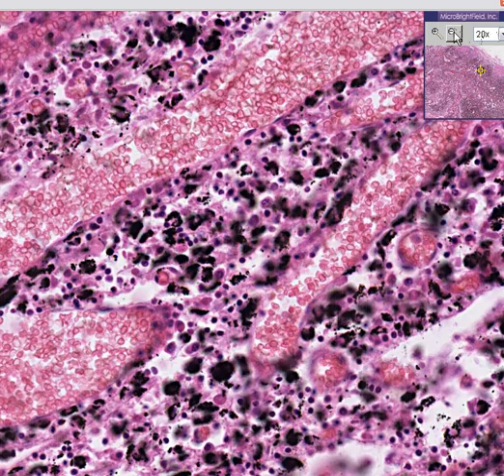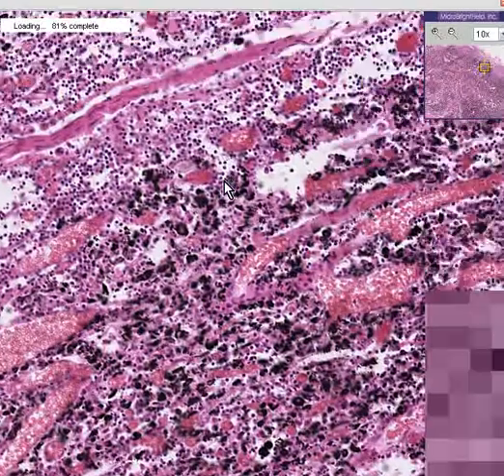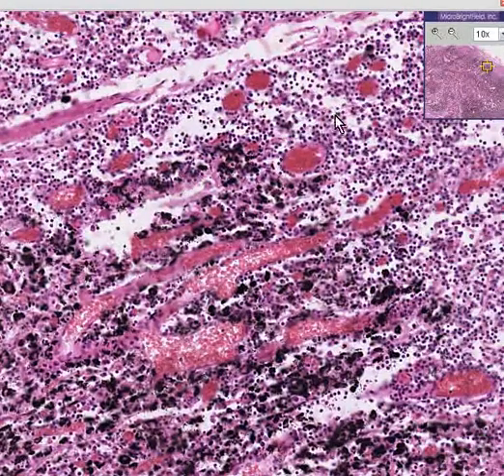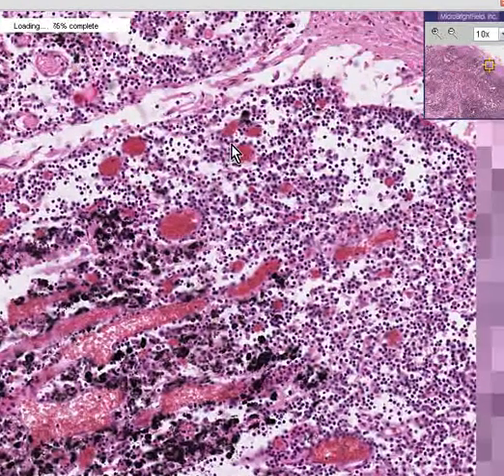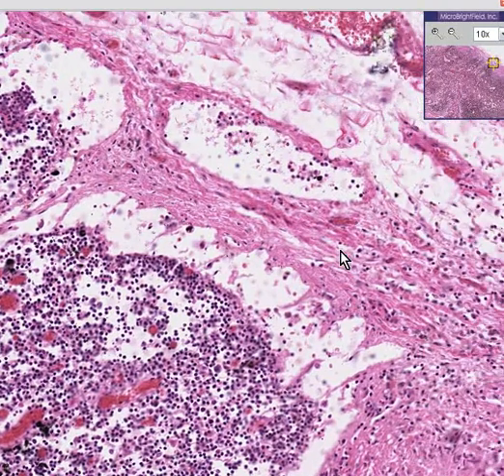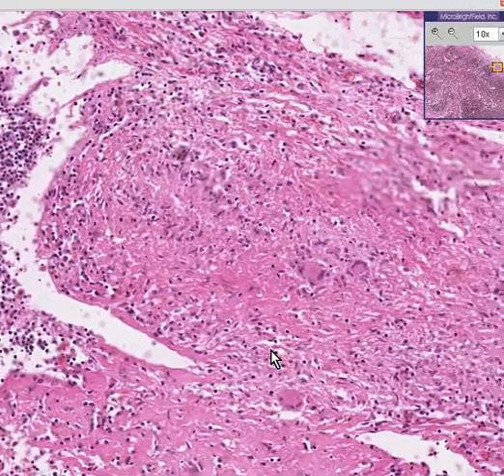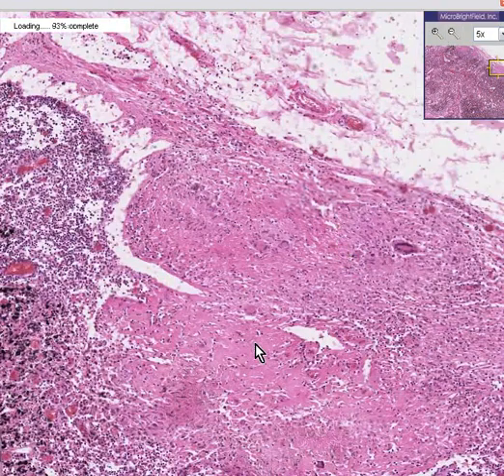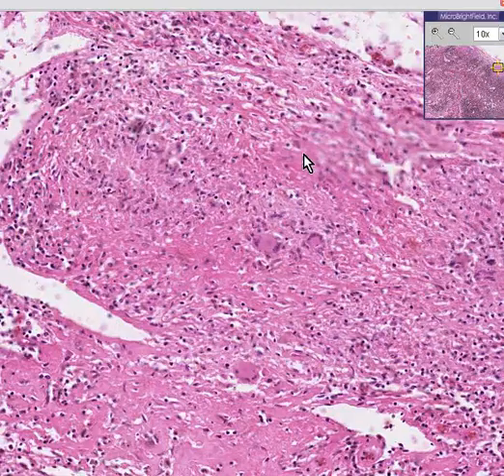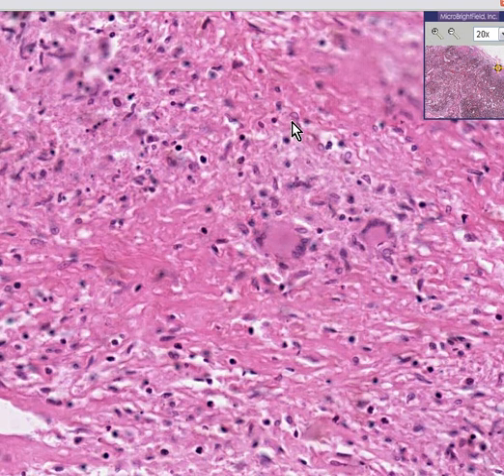However, there is something on this lymph node that is associated with a disease. In addition to these little soot, carbon, anthracotic particles, you see the capsule of the lymph node here, the subcapsular sinus. And in addition, you see these little nodules, granuloma-like structures. And the reason why I call them granuloma-like structures is because they are granulomas. And in addition to being granulomas, they have kind of a granularity to them, which makes you think they are necrotic. And they are necrotic.